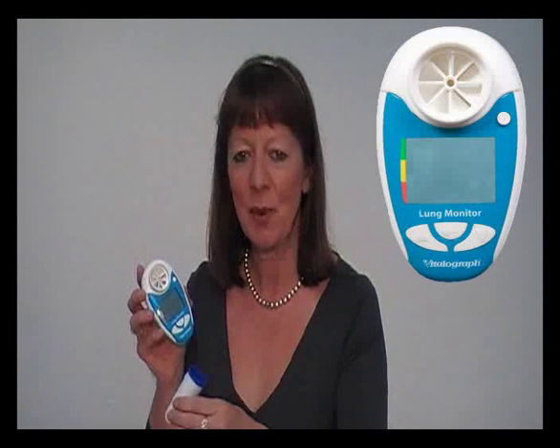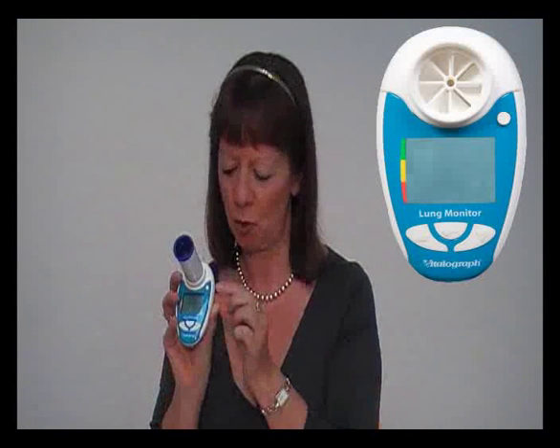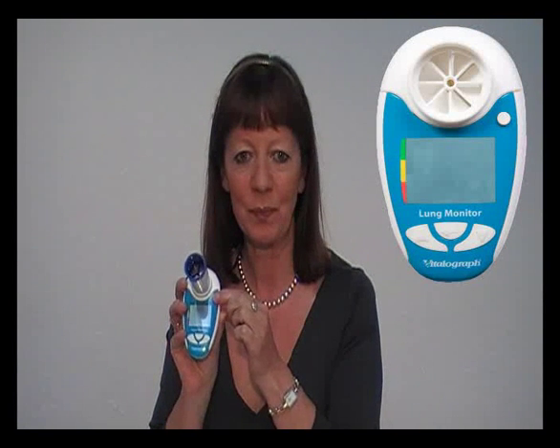Insert a safety mouthpiece and then use the circular button to switch on the Lung Monitor. You are now ready to perform a test.